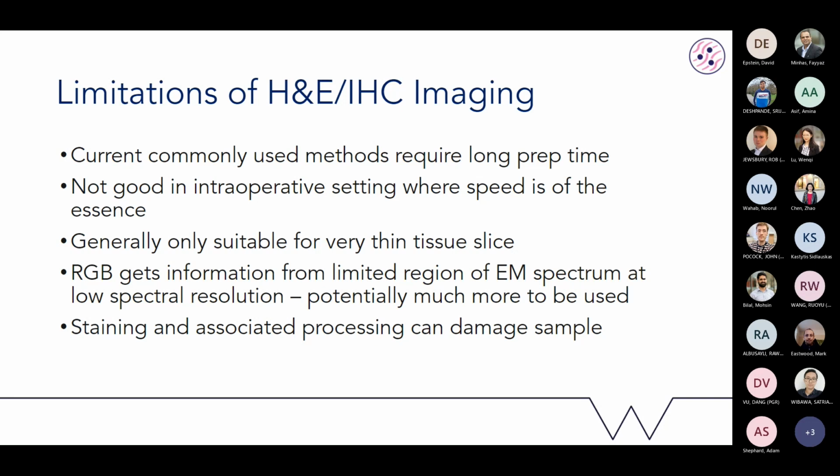But you can also just be looking within the visual spectrum, at a finer resolution than just these 3 RGB. Maybe split it up into, I don't know, 10 different bands over the visible spectrum and get more fine-grained information that way.